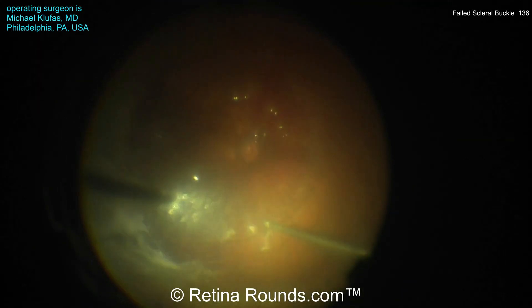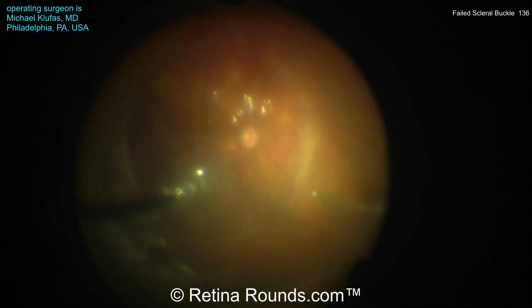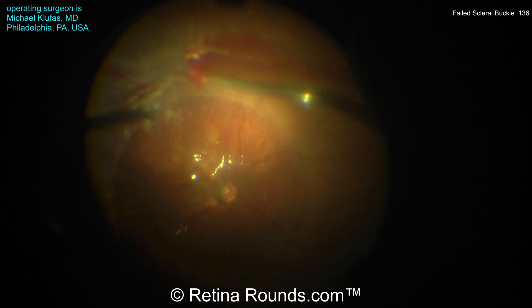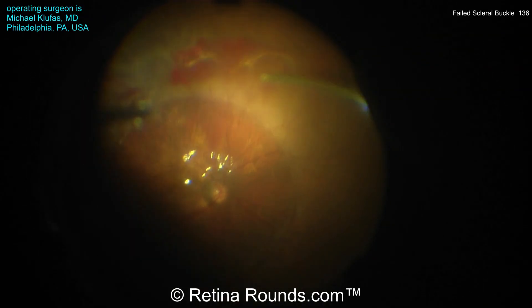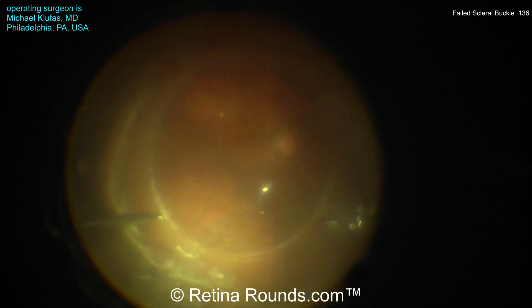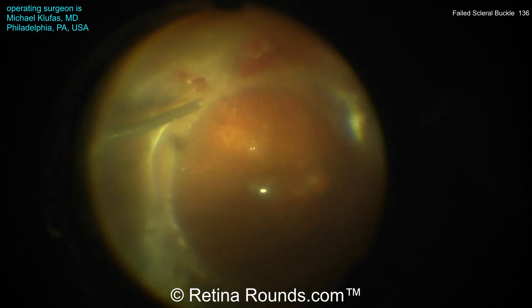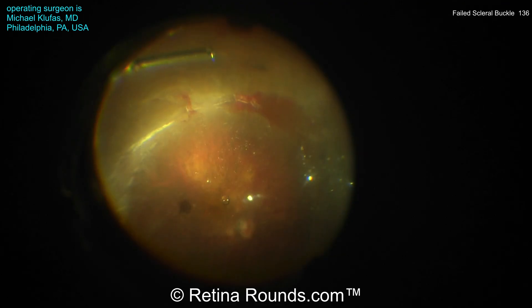Using a perfluorocarbon liquid can serve as almost like a third hand to hold the retina down while he's elevating up the PVD. You can see here he's using some additional triamcinolone just to better visualize the vitreous, and he's using the shave mode. This is a surgery that's being performed with the Eva Nexus. You can see here that he's doing a combination of elevating with the vitreous cutter and shaving the vitreous with the cutter, taking care to use this shave mode to efficiently remove the vitreous but also not to create too much turbulence and potentially create an iatrogenic retinal break. So it's this very careful combination of shaving, elevating, and then further elevating up the perfluorocarbon liquid to stabilize the retina.